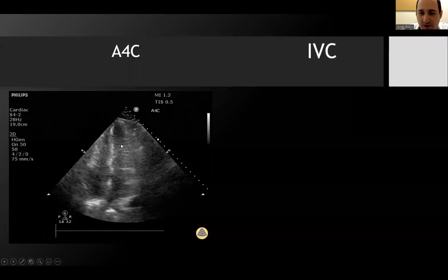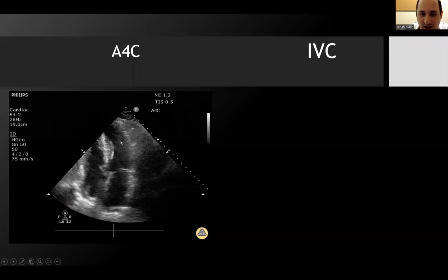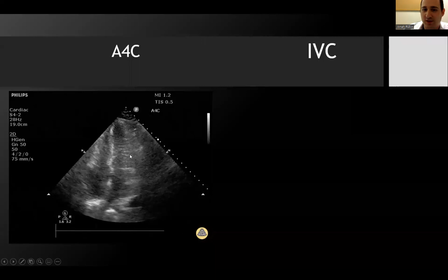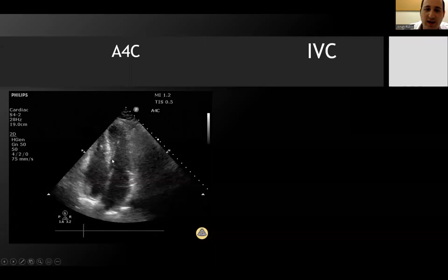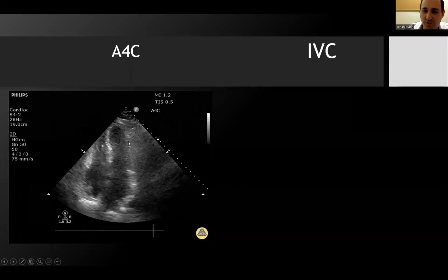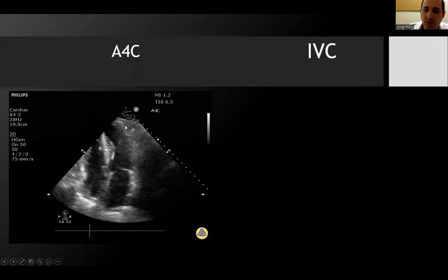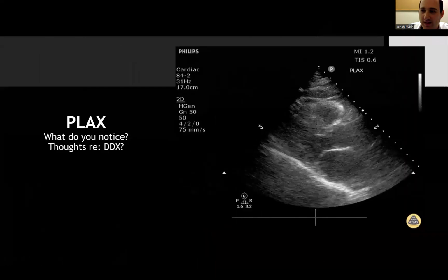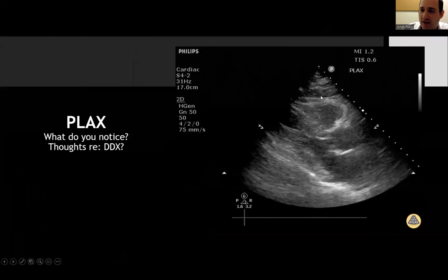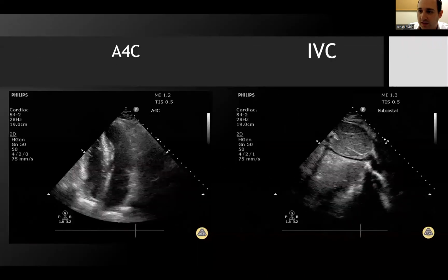And this heart is just completely contracting, right? If the endocardium is sort of here, and this is just a papillary muscle waving around, then you could argue that perhaps this LV is not moving as much. But this is a perfect representation of how we need to get this from multiple views, where if you just saw this view, you would have to be very careful about calling anything about LV function. But together with perhaps this, we can be more convinced now that this is an underfilled or hyperdynamic or both left ventricle.